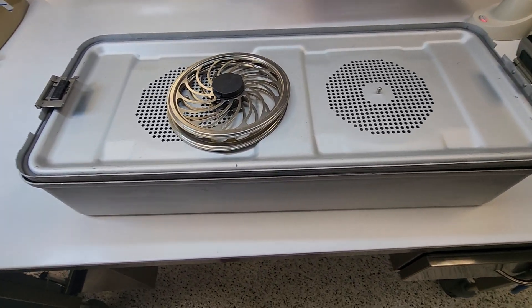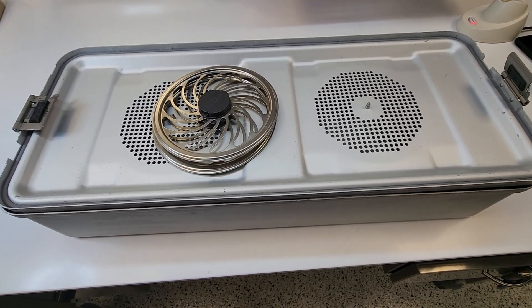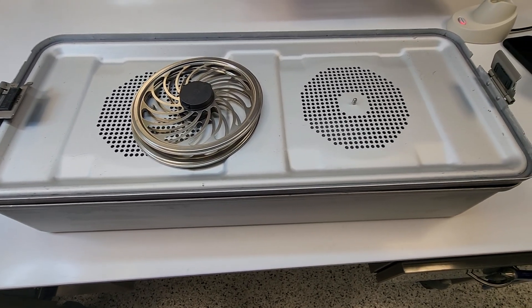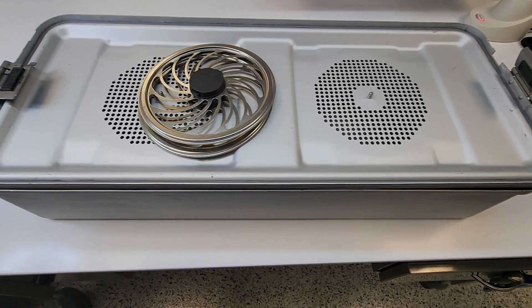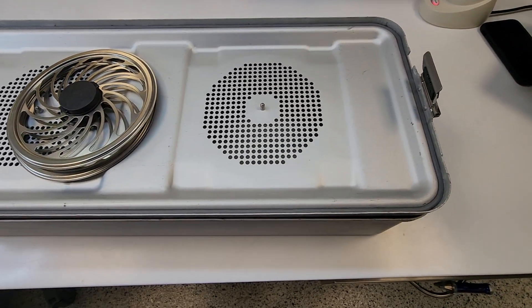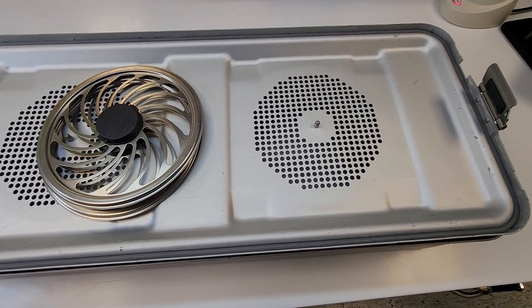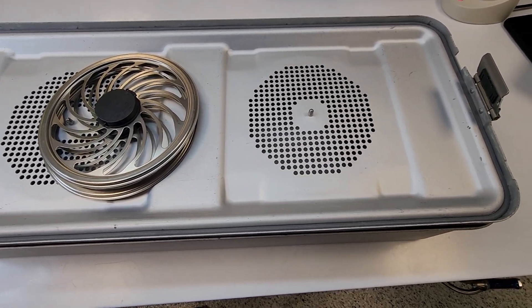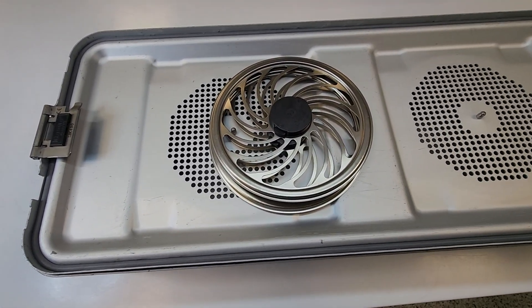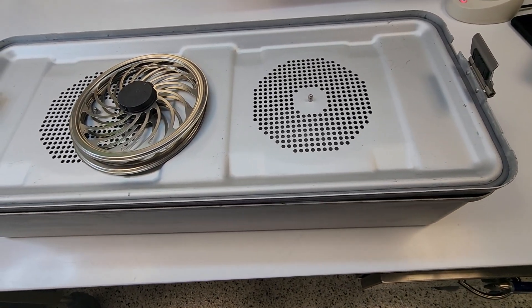Welcome back to WDYDCSP — What Do You Do as a Central Sterile Processor? So you finished assembling the tray — good job — but you're not done yet. Next you have to figure out what container system or barrier system you will be utilizing to sterilize your tray. First, find out: are you doing a pre-vacuum sterilization cycle, a gravity sterilization cycle, or a low temperature cycle? In this instance, we are doing a pre-vacuum cycle, and this is the container we will be using.